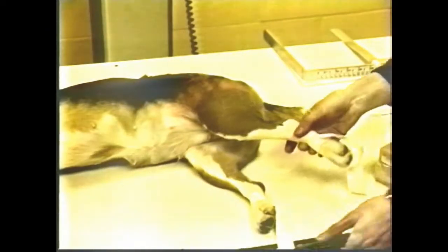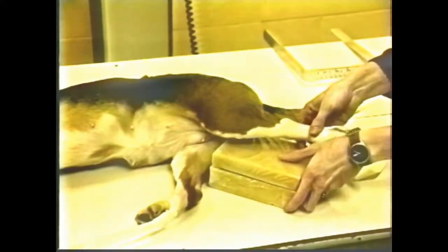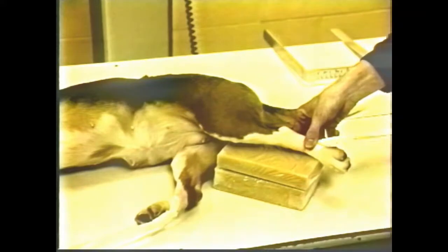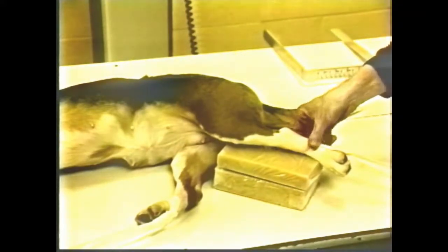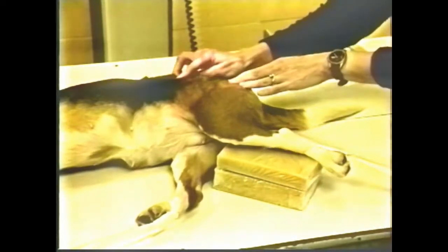To obtain a properly positioned lateral view of the pelvis, the animal must be in lateral recumbency. Tape is placed on each foot, allowing positioning of the legs to be separated. The leg of primary interest or side should be down. The down leg is pulled forward and the upper leg is pulled caudally and blocked up so that the femurs are somewhat parallel by a sponge.